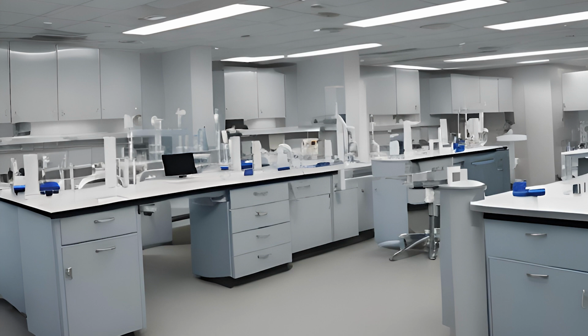If you're using a phlebotomy chair, what you want to do is you have the patient sit down. You'll adjust the arm on the phlebotomy chair so that they can lay their arm out comfortably on that armrest. It shouldn't be so low that their arm is at an odd angle. It shouldn't be so high up that their arm is sticking straight out in front of them. You want their arm to come down with their elbow at a slight angle.